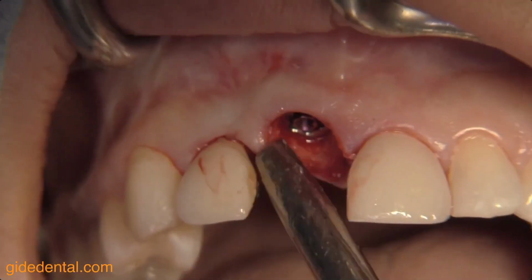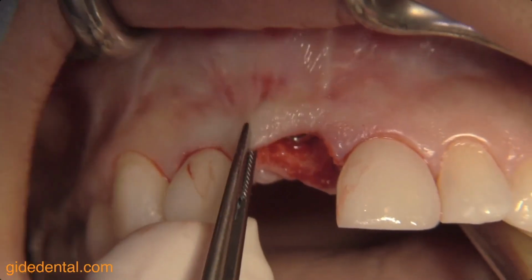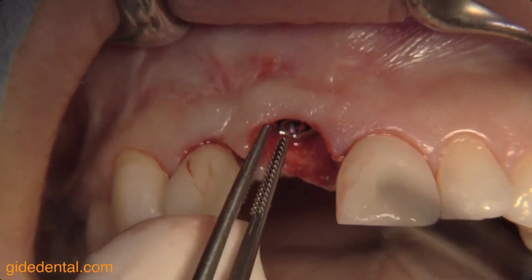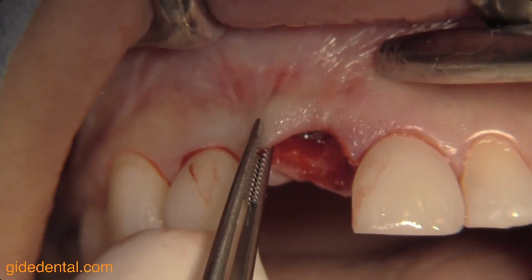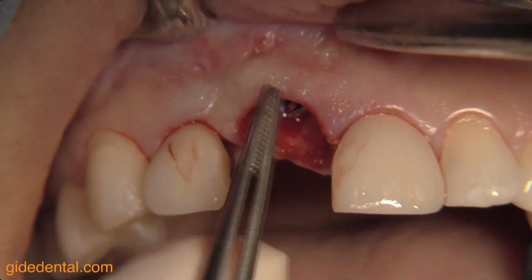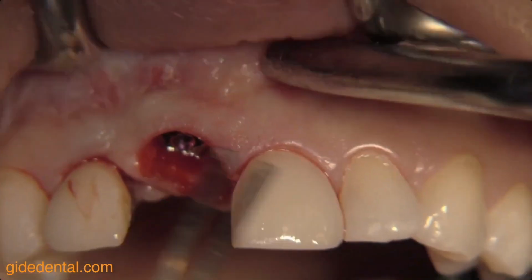And what I want is I want that soft tissue, here you can see that, to be so loose that I can move it coronally. Here I'm using one of my microsurgical pliers, which are very efficient and very atraumatic. Here you can see that. The coronal repositioning, nice in this area. And here's the tunnel.